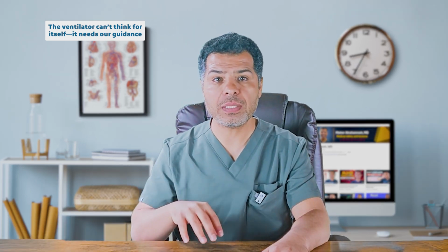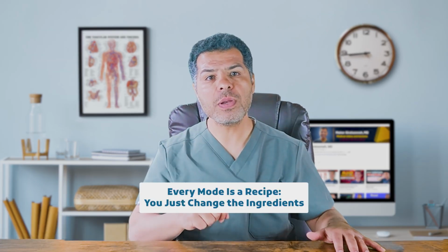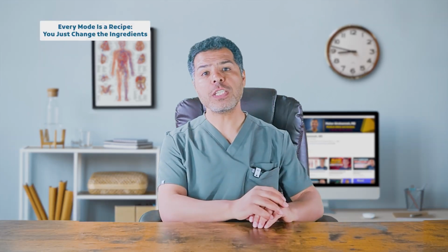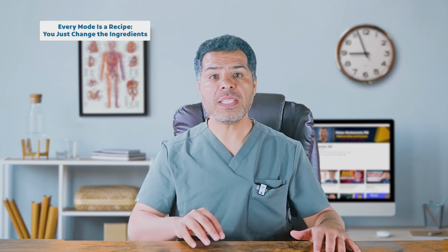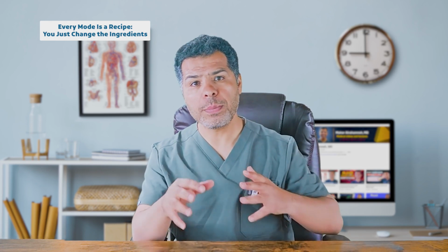And this brings me to the seventh concept, concept number 7. Every mode is a recipe, you just change the ingredients. Think of each ventilation mode like a recipe the ventilator follows to deliver a breath. The basic components of the recipe don't change, but how we mix them does.